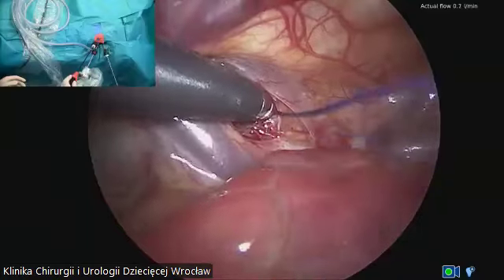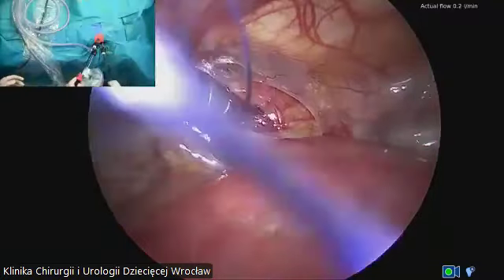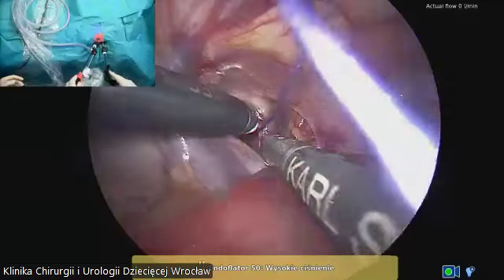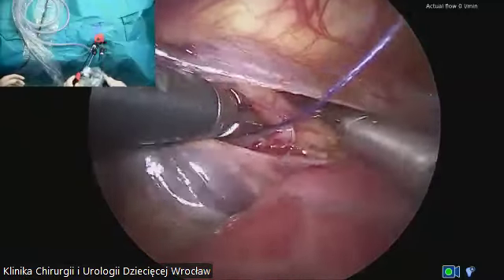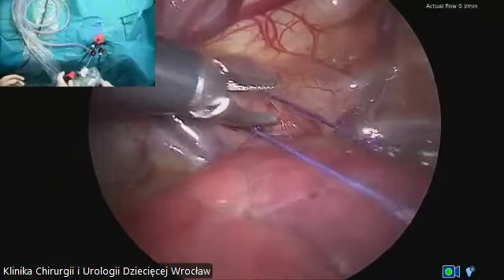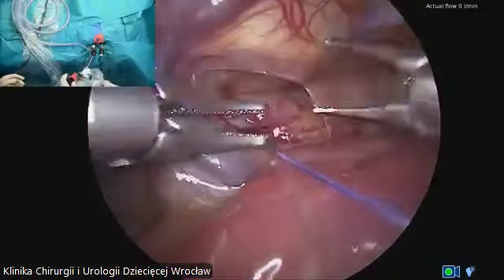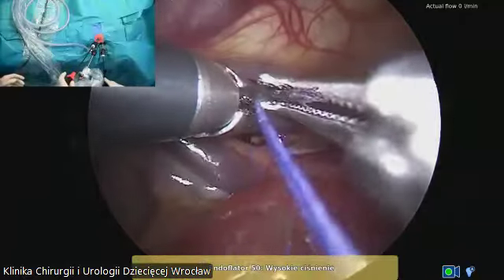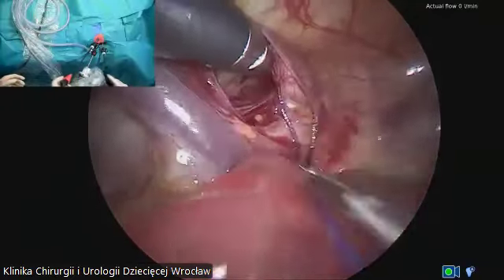Yeah, you know, that's the advantage of minimal invasive surgery, that you can go into the chest again without too much harmful procedure for the baby. Okay. The only thing I would like to do is dissect it a little bit more up. You can see that we are at the level of the trachea.